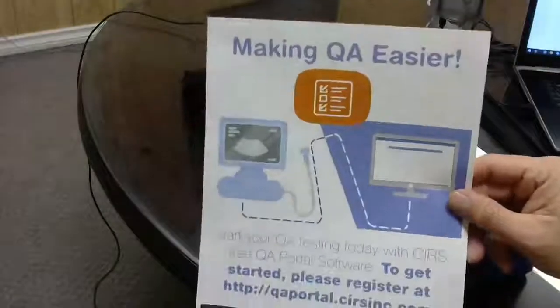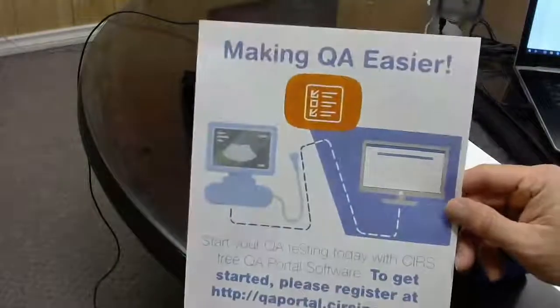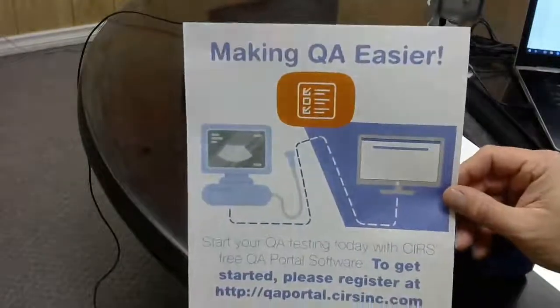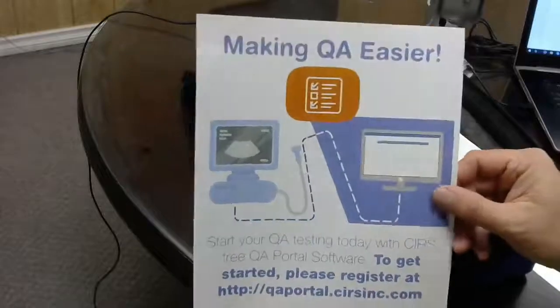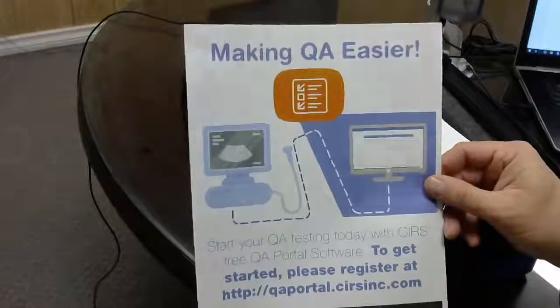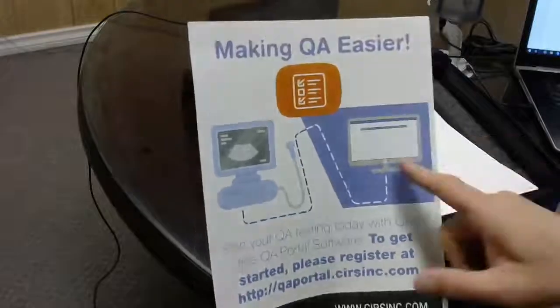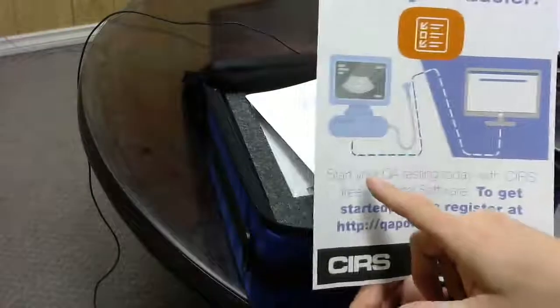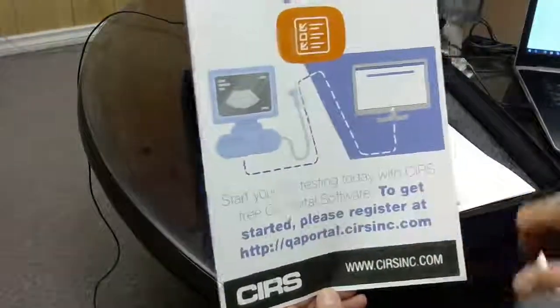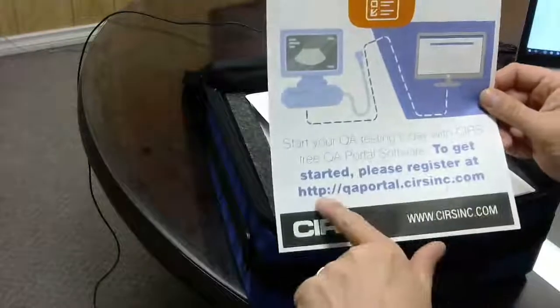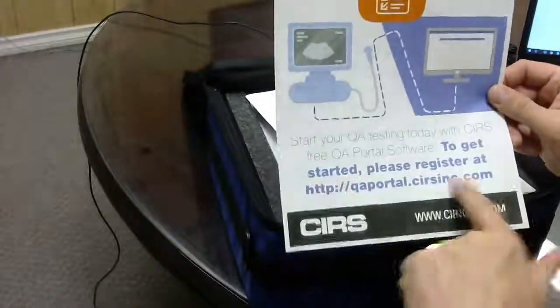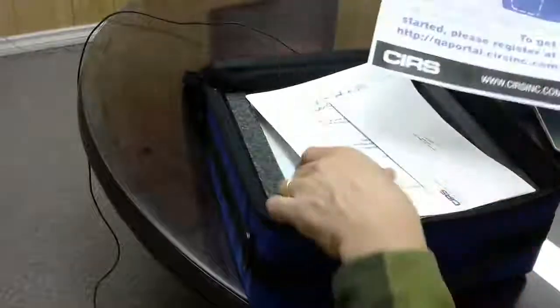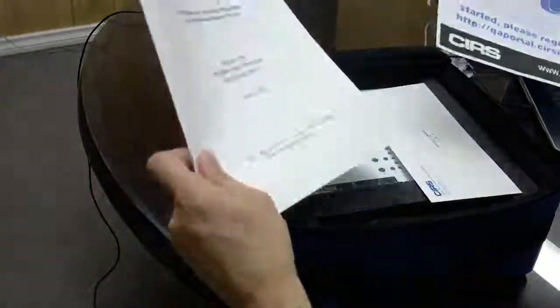This is the software that CIRS is offering for your QA to store your data measurements. If you take a look at the software portal, it's a QA portal that CIRS has set up.